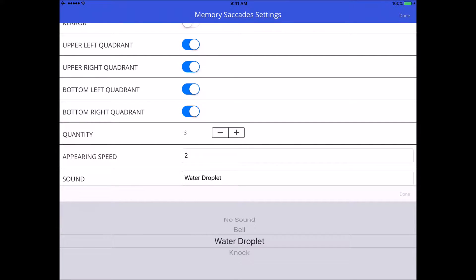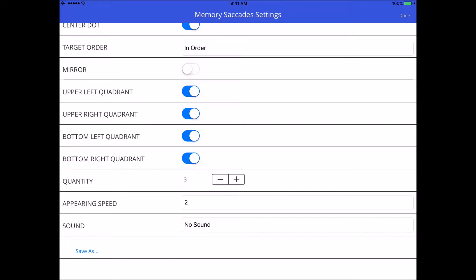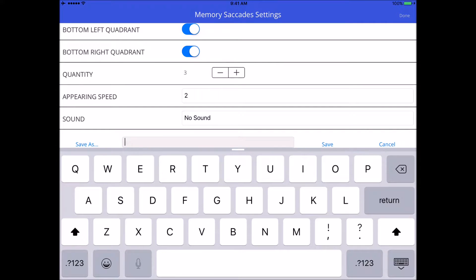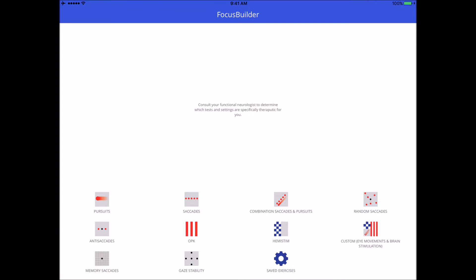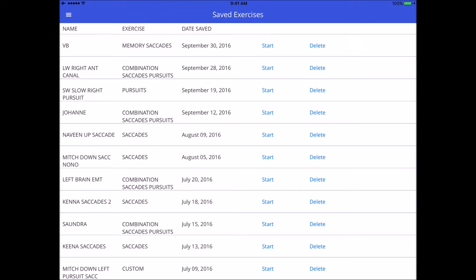You can decide if you want a sound to go along with the exercise, but when I play my iPad projected and record it while it's plugged in, the sound doesn't come out, so I can't demonstrate it in this video. It works really well though and I love that sound factor. At the very bottom you can press save, add your patient's initials or whatever you want to call it, and once saved it'll appear in your saved exercises from the home screen, bottom right.